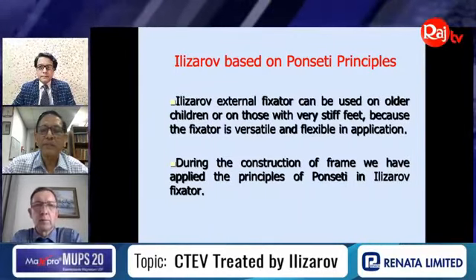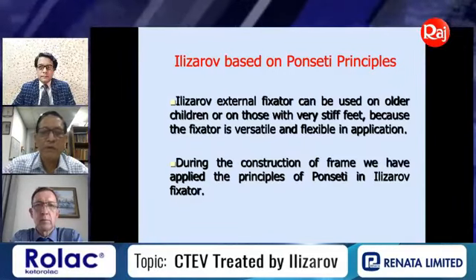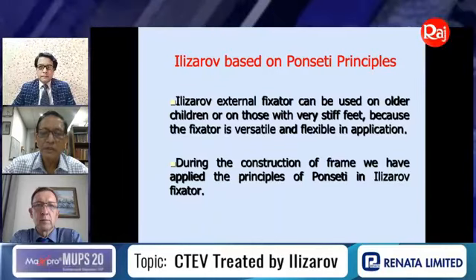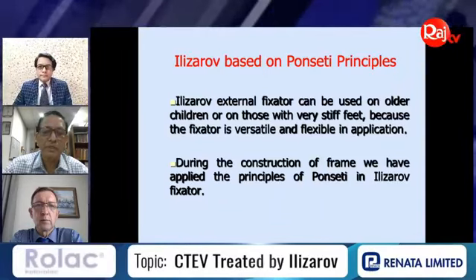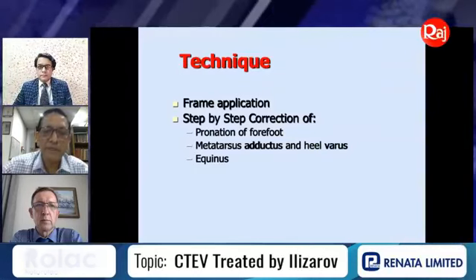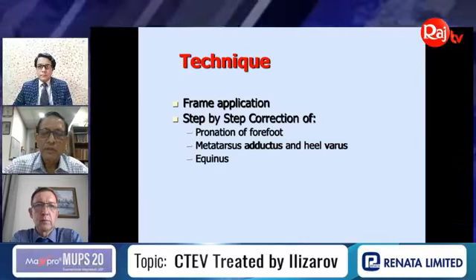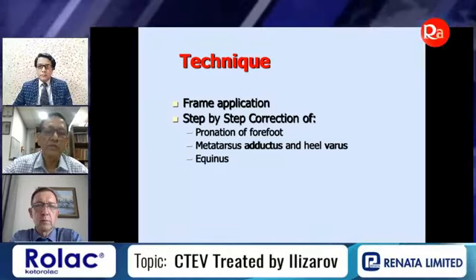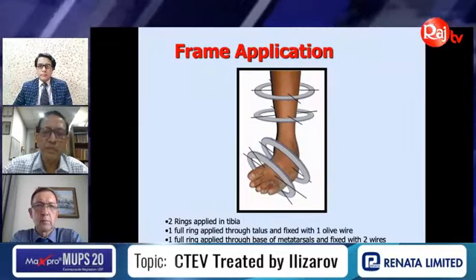Ilizarov external fixation can be used in older children or those with a very stiff foot, because the fixator is versatile and flexible in application. During the construction of the frame, we have applied the principles of Ponseti in the Ilizarov fixator. So our technique is frame application, then step by step correction of the pronation of the forefoot, then metatarsal adduction and heel varus, and in the last, equinus is corrected.